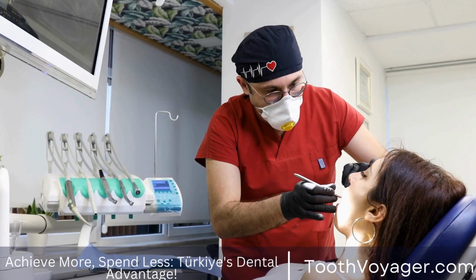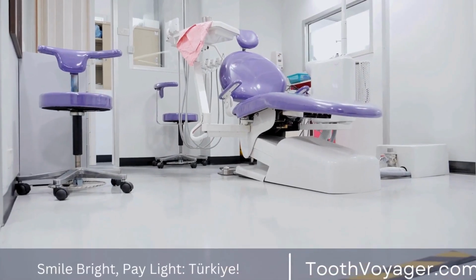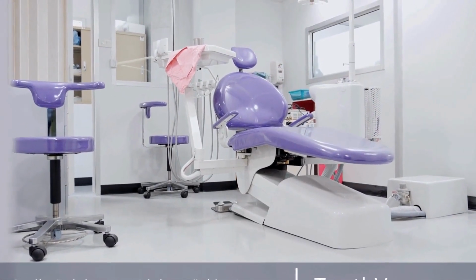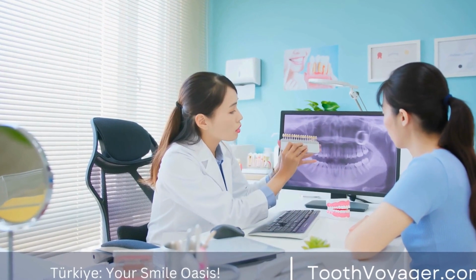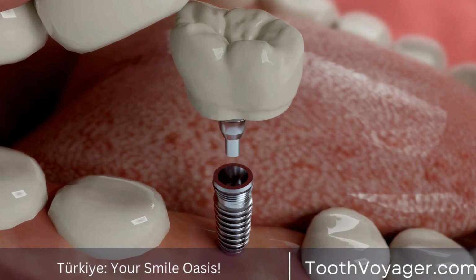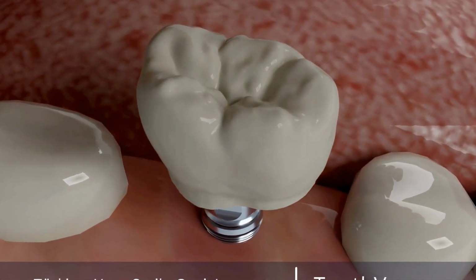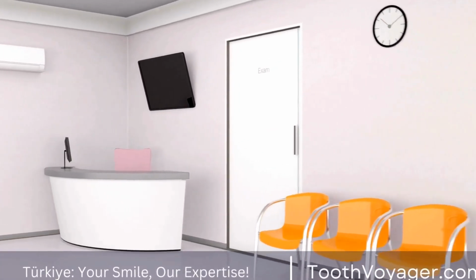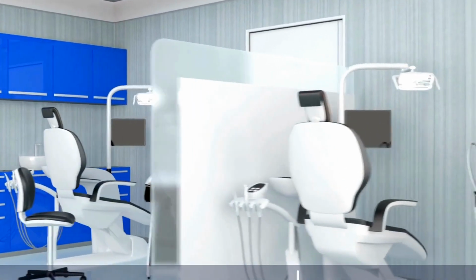1. Traditional dental implants. Dental implants that are traditional are the most popular type of implant, and they have an average success rate of up to 98%. Implants consist of three major elements: the implant as well as the abutment and the crown. Implants are surgically placed in the jawbone where it bonds with bone with time, creating an extremely solid foundation for the new tooth. The abutment then is attached to the implant and serves as a bridge to the dental crown, which is the visible portion of the new tooth.